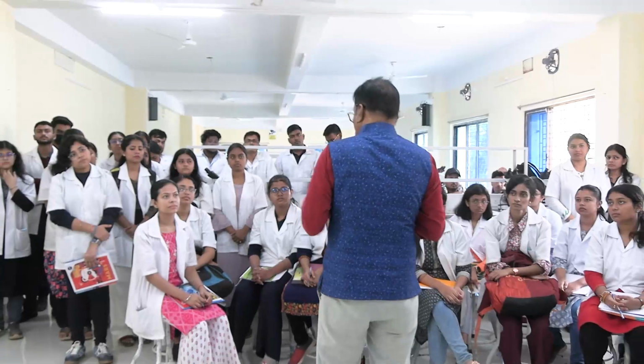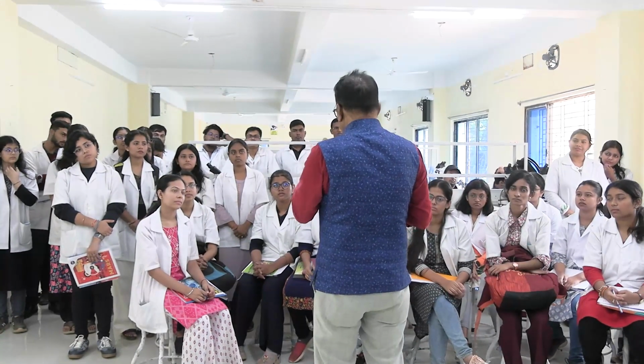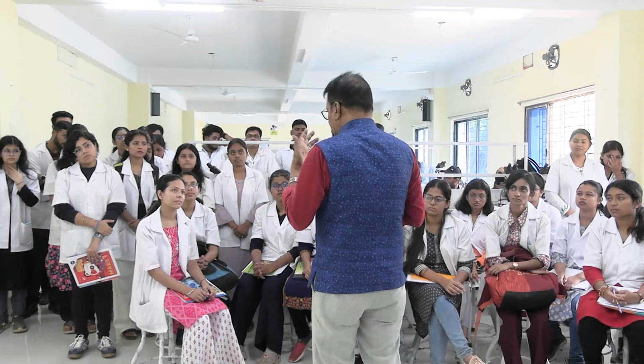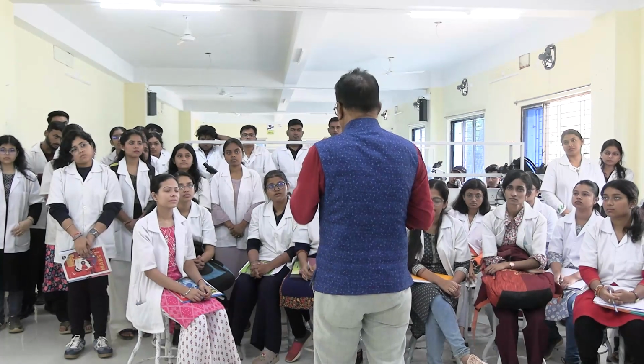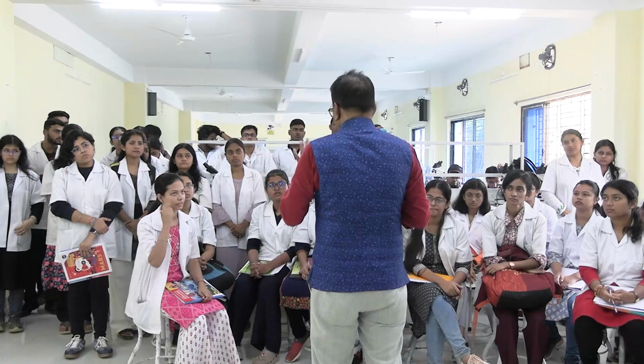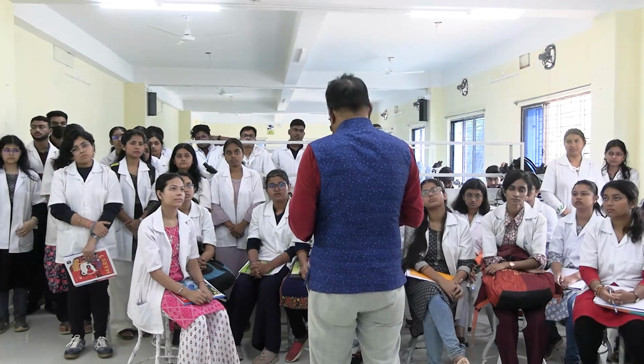So the neutrophils are lobulated. They have different numbers of lobes according to their age. Having 6 lobes means they are elderly, and now it is their time to die.